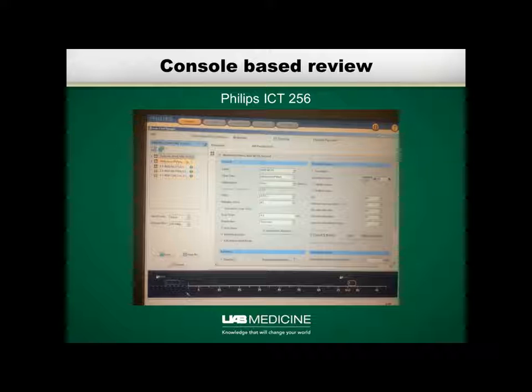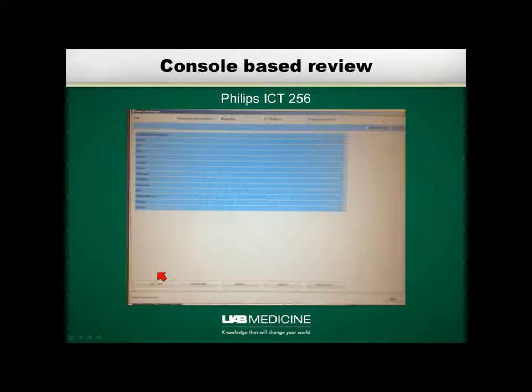I think it's a little bit more user-friendly in that you have more information on the screen at a time. One thing that's a little bit different is, again, we've got this hierarchical menu up here. You notice you don't specify the abdominal coronal is built straight off of the acquisition. You don't have to tell it which of your axial acquisitions the coronal is built off, which is a difference in the way the protocols are set up that I'll be getting to a little later.